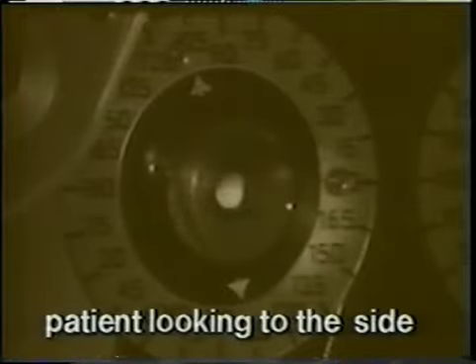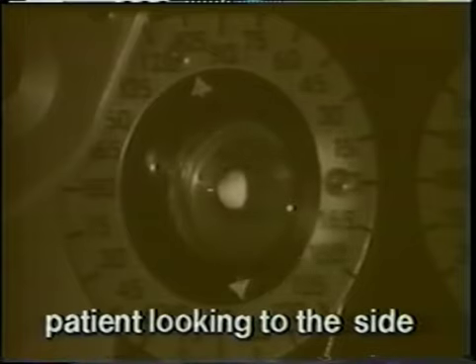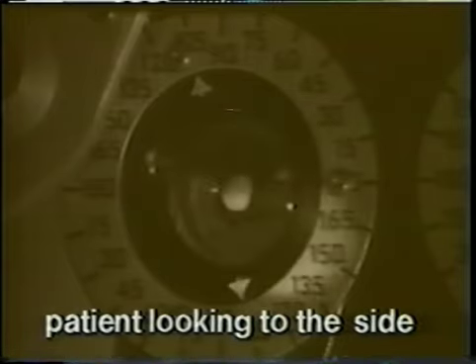In this next patient, we suddenly notice the reflex spontaneously changing, but not from accommodation. Notice that it changes in brightness as well as in its movement. It often becomes whiter as well, but we cannot show that here. The patient is looking off to the side, and you are either retinoscoping nasal retina or the optic disc. Redirect his attention to the fixation target at the end of the room. That's better. What about irregular reflexes?